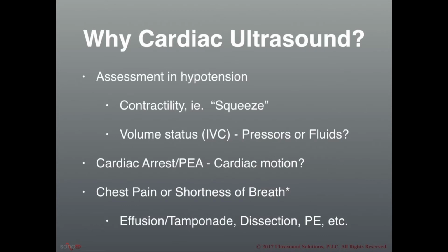Why would we do cardiac ultrasound in the emergency department? How does this bring value to our patients? Well, we see a lot of patients with hypotension, or low blood pressure. One way to think about the heart is simply as you would any other pump. It is a pump that requires fluid coming into it and pipes to send the blood out of it. And so often we think of evaluating the cardiovascular system as evaluating the pump, the pipes, and the tank. When you're evaluating the pump, or the heart, you want to know how good is its squeeze. What is it able to do with the blood volume that is coming into it?